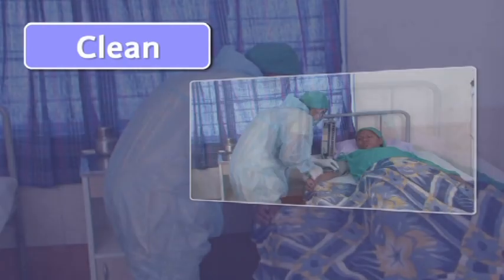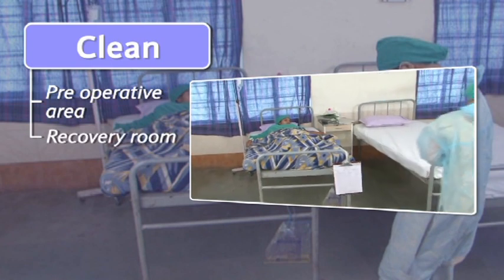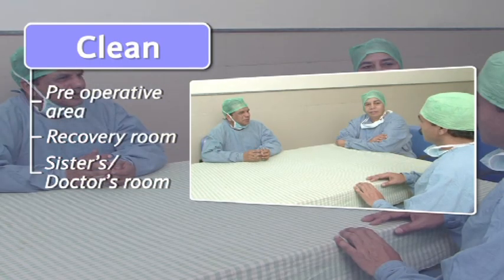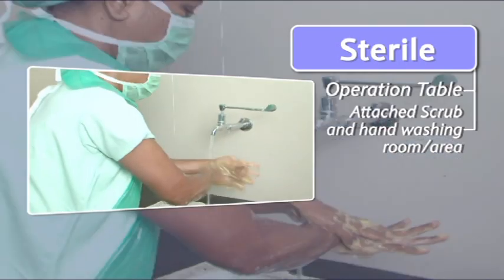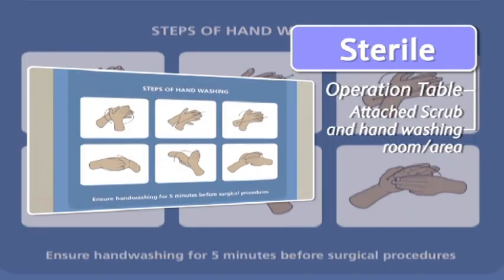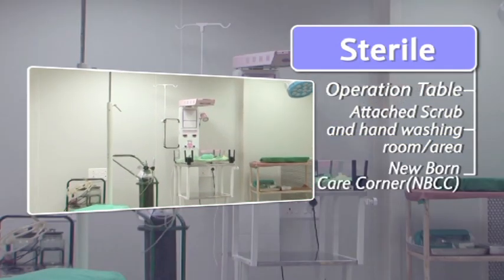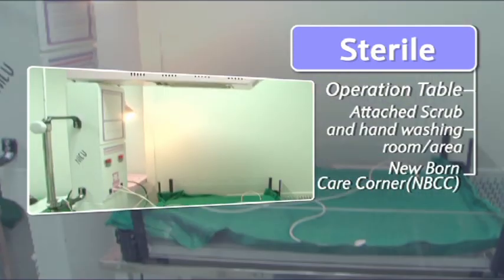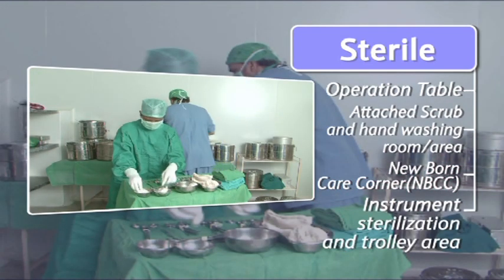Similarly for clean area, pre-operative area, recovery room, sisters or doctor's room. Sterile: operation table, attached scrub and hand washing room or area, newborn care corner, instrument sterilization and trolley area.